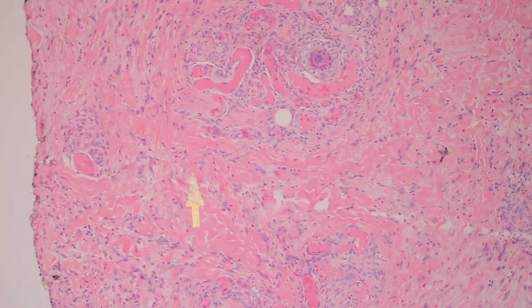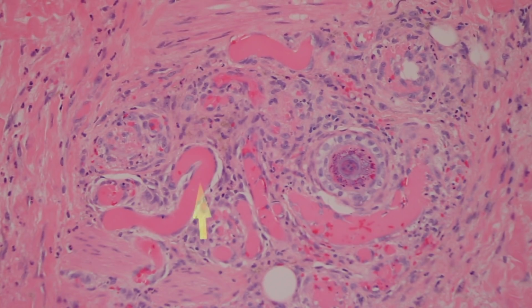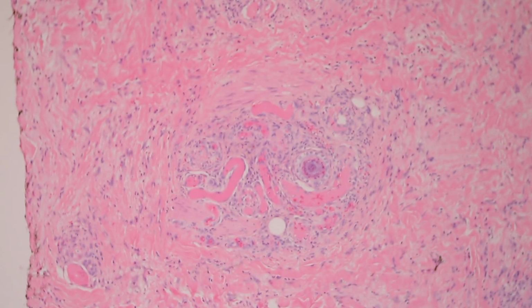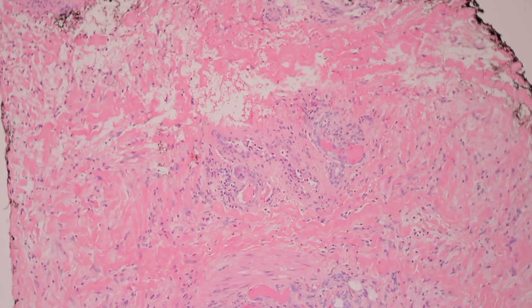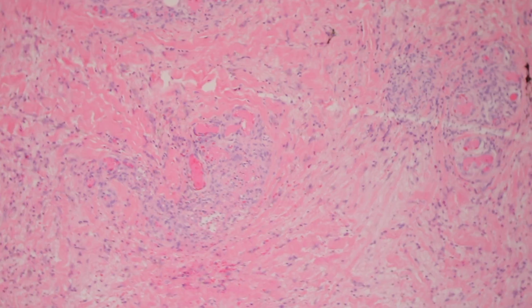This one, even though it's cut funny, you can see just how dense and pink and bright the cryoglobulins are, and they actually light up on PAS stain usually. So doing a PAS stain will sometimes help show the cryos, and also if you have an IF. And of course, clinically, they can draw blood and test for cryoglobulins through some specific laboratory testing that can be done. So a nice example of mixed type cryoglobulinemia, which also gives you a neutrophilic vasculitis. The vasculitis is much more subtle here, but there is vascular damage and there are neutrophils around the vessels.